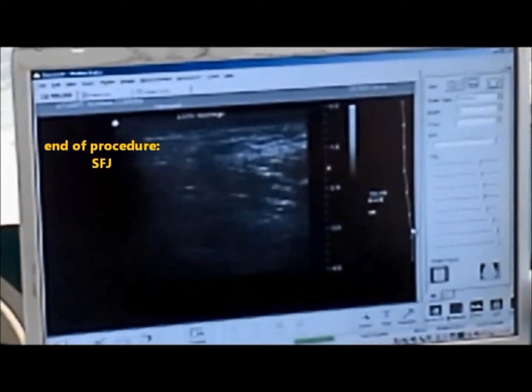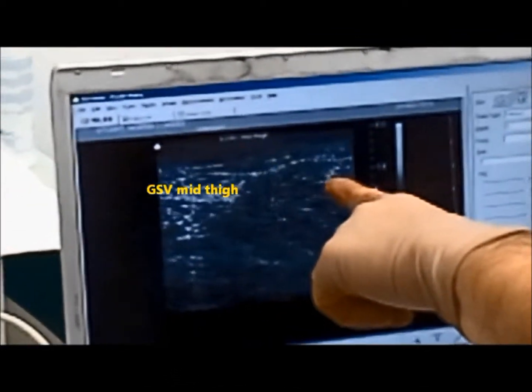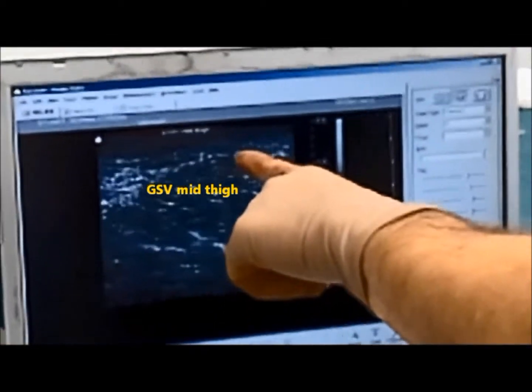After the catheter has been removed, the surgeon checks for saphenous vein occlusion using ultrasound. At the end of the procedure, the patient is encouraged to walk immediately and to resume normal daily activities.